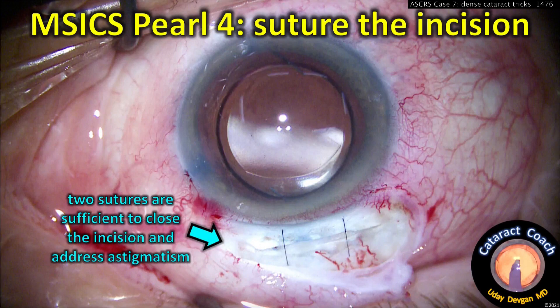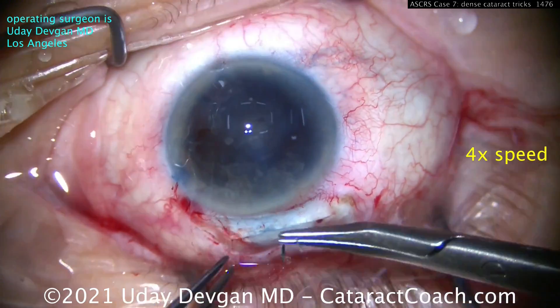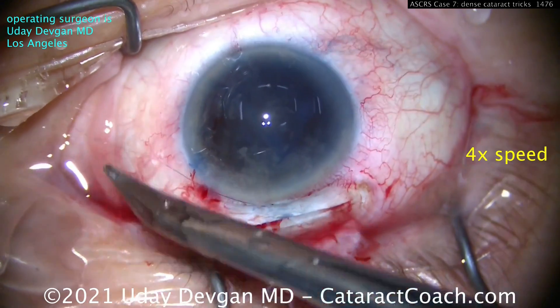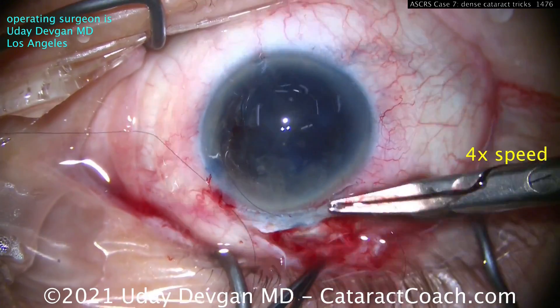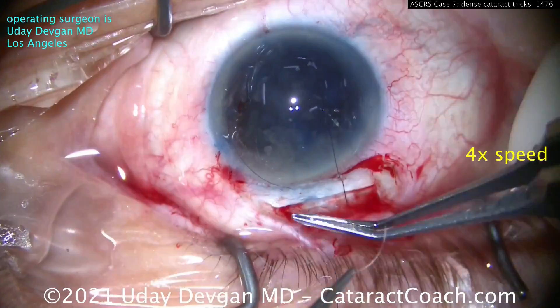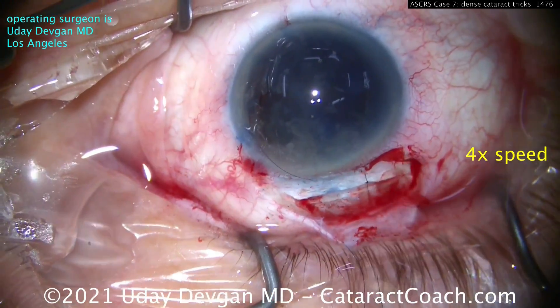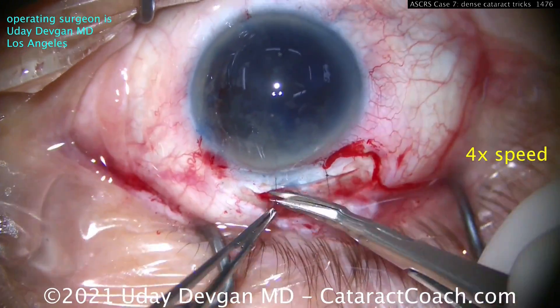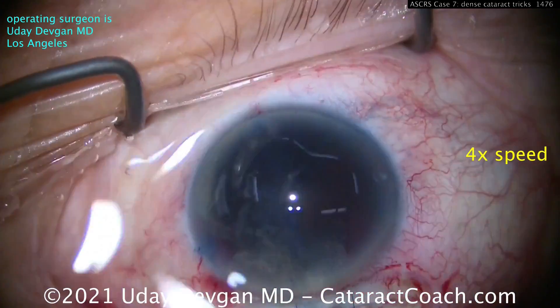Now the last thing is to suture the incision. A lot of surgeons experienced with MSICS don't suture the incision, and that's done primarily outside the U.S. — if that's your preference, fine. But I like to put sutures in; you don't need much. This is just two loops of 10-0 nylon suture to close this incision. It'll give you a very nice result, and you'll minimize the amount of astigmatic shift over time. These 10-0 nylon sutures are going to be buried and will be there permanently — no concern.